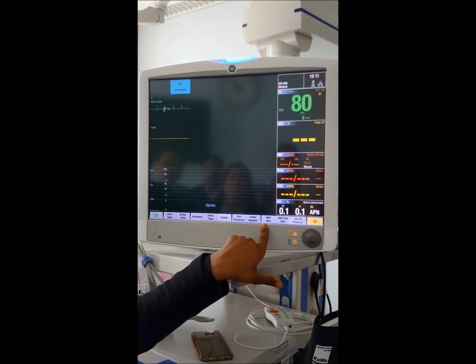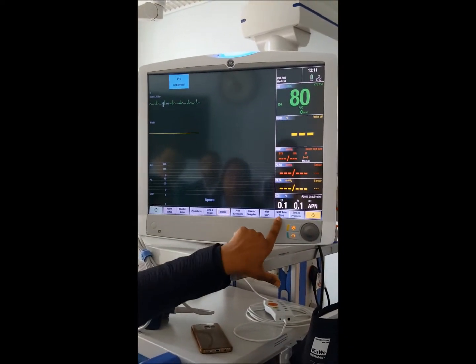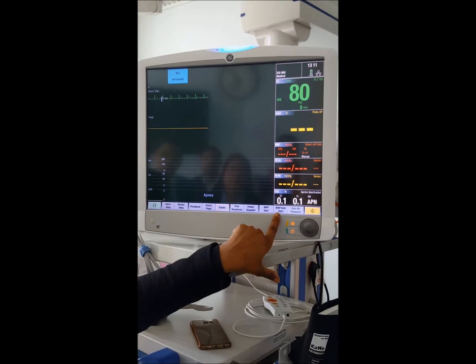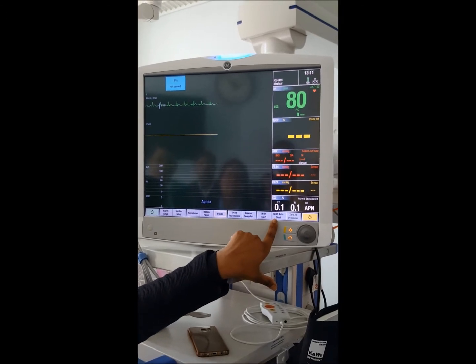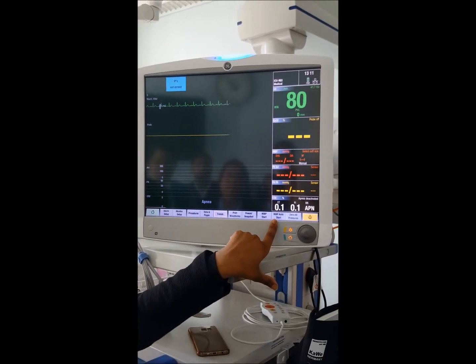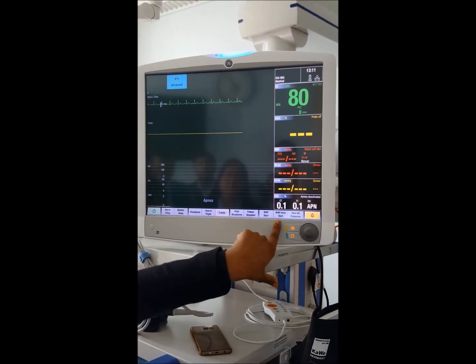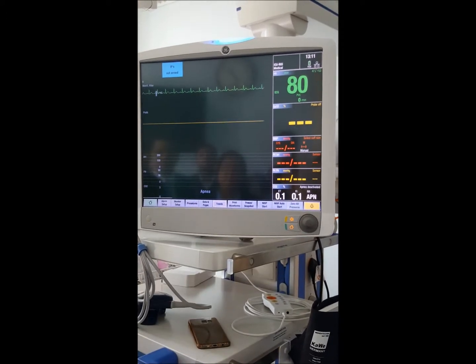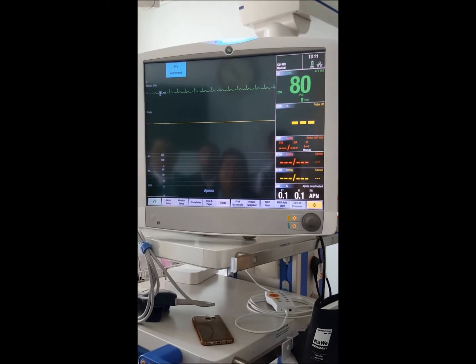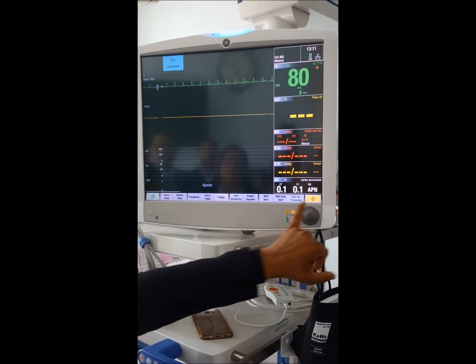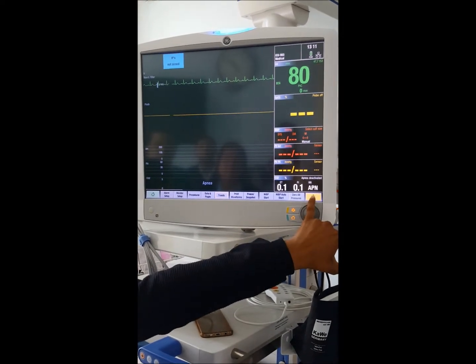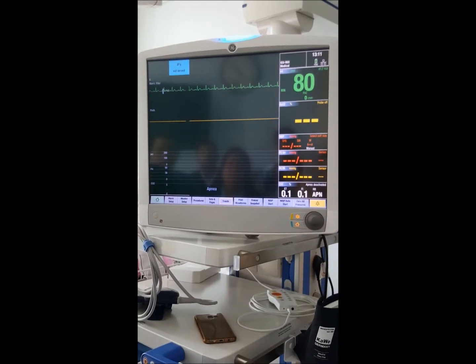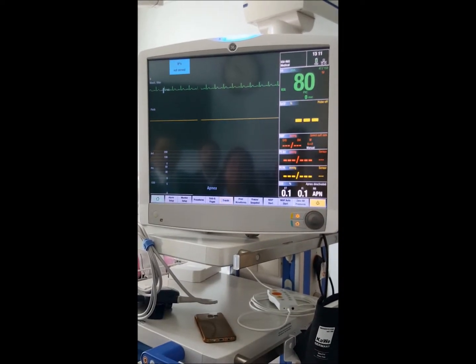The freeze feature is like a selfie for the monitor. The other shortcuts are NIBP start for manual BP, automatic NIBP with intervals, zero pressure for invasive blood pressure, and silencing alarms.